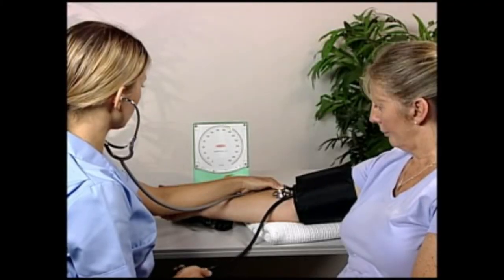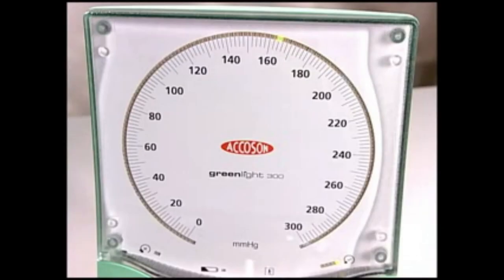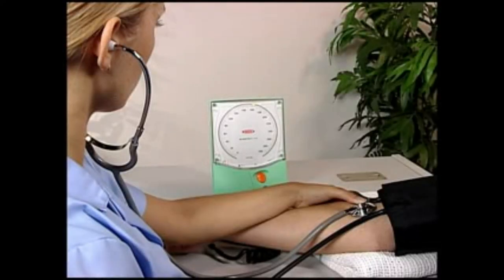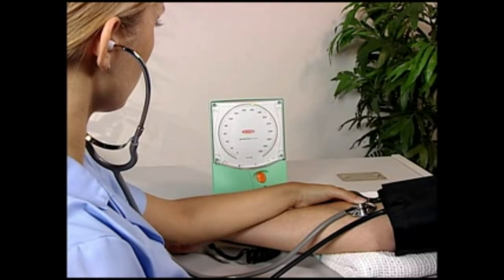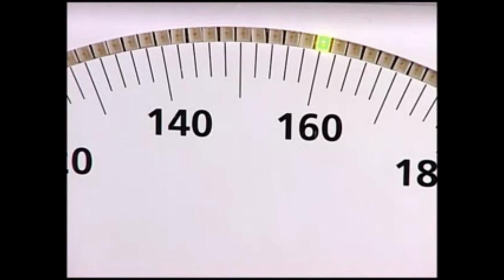Now begin to reduce the cuff pressure. The American Heart Association recommends a cuff deflation rate of 2 millimeters of mercury per second, while listening for the appearance of the Korotkoff sounds. In practice, this can seem surprisingly slow, but it is important in achieving accurate readings.